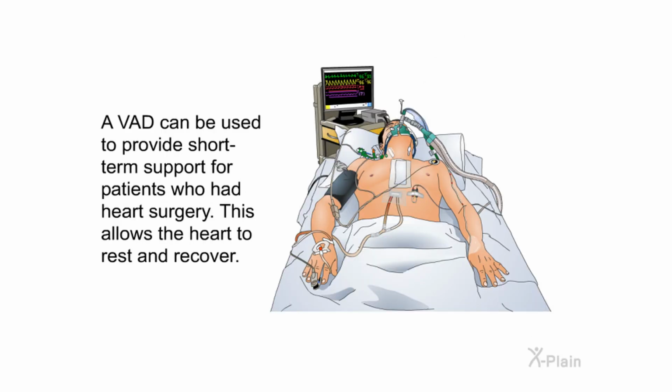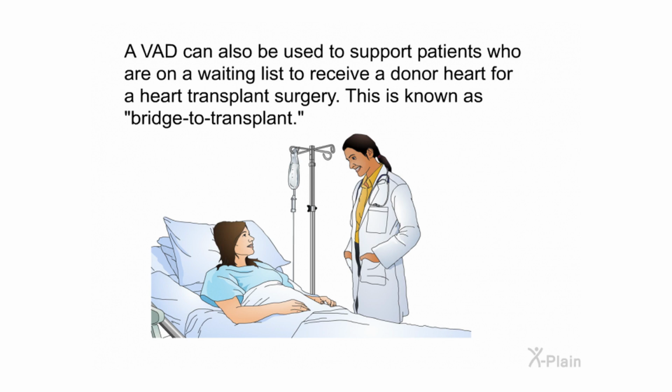A VAD can be used to provide short-term support for patients who had heart surgery. This allows the heart to rest and recover. A VAD can also be used to support patients who are on a waiting list to receive a donor heart for a heart transplant surgery. This is known as bridge to transplant.